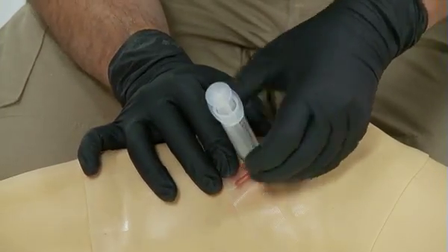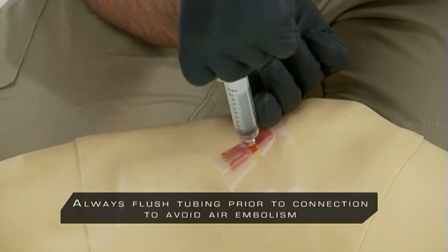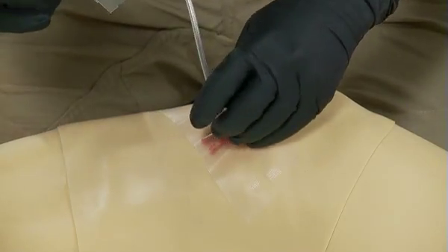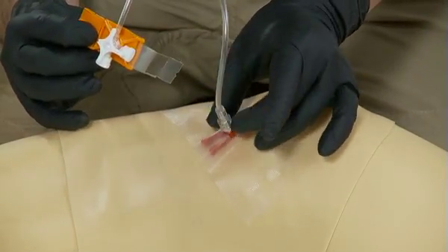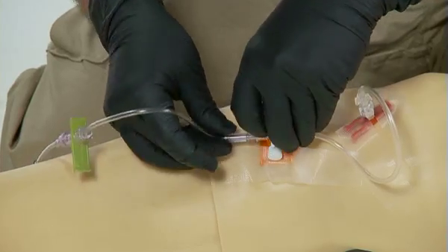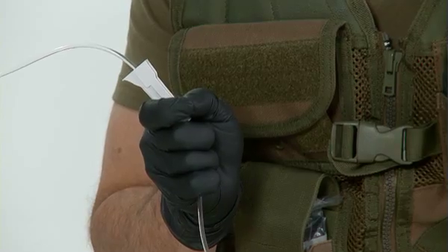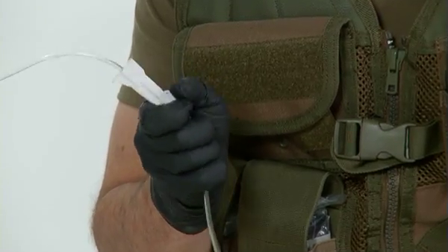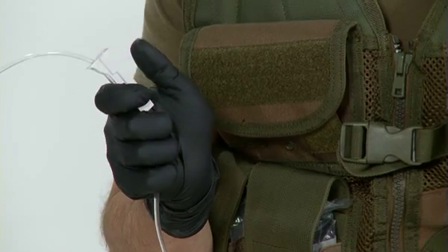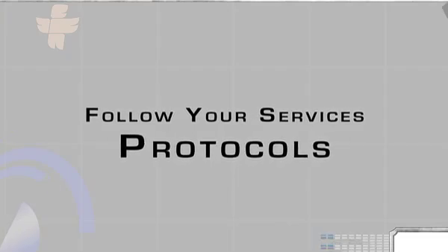Bone marrow can now be aspirated into a syringe for laboratory sampling. However, do note that a lack of bone marrow does not mean the IO is improperly placed. Connect a stopcock or an extension set to the cannula. Flush 20 to 30 cc's of saline before injecting fluids or drugs. In conscious patients, consider administering a local anesthetic prior to administering fluids. Fluids and drugs can now be administered as required. As always, follow your service's protocols.